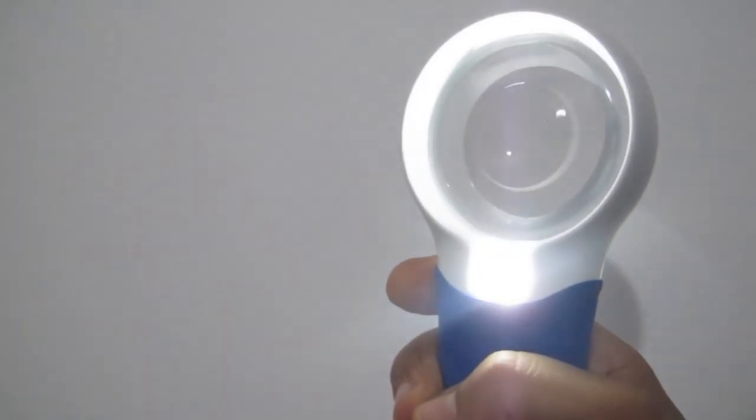Both of these magnifiers work in the same way. They are touch sensitive, and they have LED light. So when you hold it, it lights up, and you just hold it at a certain distance from your book, and you read with them. Very simple. The AT-8 magnifiers are rechargeable with plug-in chargers, which I prefer honestly, but the AT Max works with AA batteries that go in here.